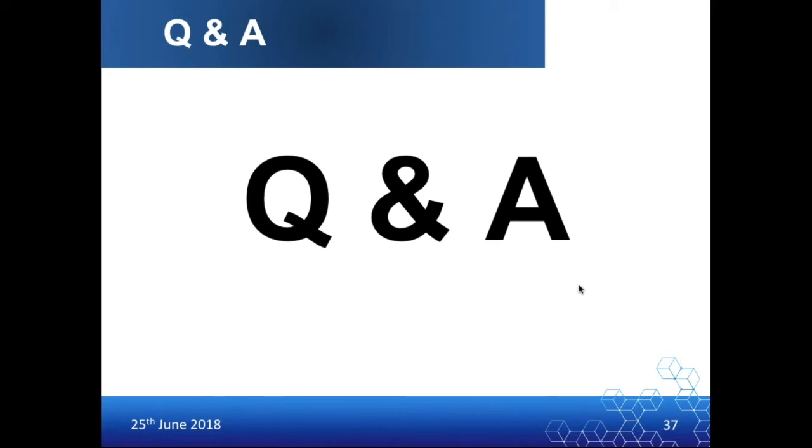Yeah, okay, thank you, Doris. So the second question we have is, what medium did you use for your air liquid interface culture? The cells were obtained from Lonza, and we have used the medium that is provided, which is commercially available with the cells from Lonza.